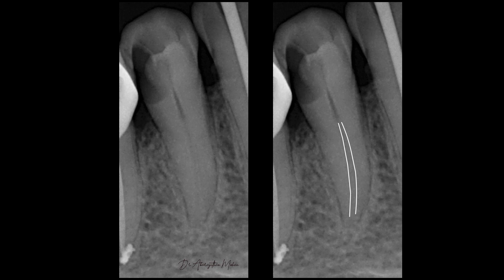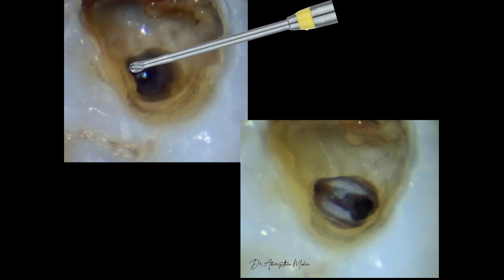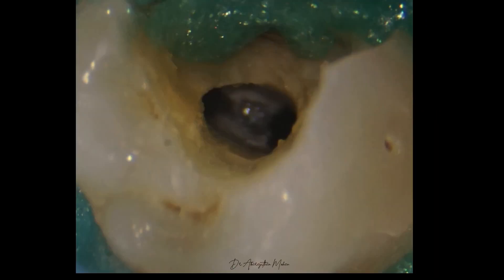They can also be used to manage cases with deep splits. This is a mandibular premolar where you can see that we need to de-roof a little deeper to expose the lingual canal, and here also they can come in very handy.